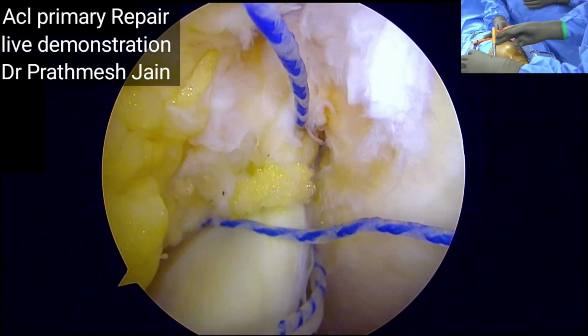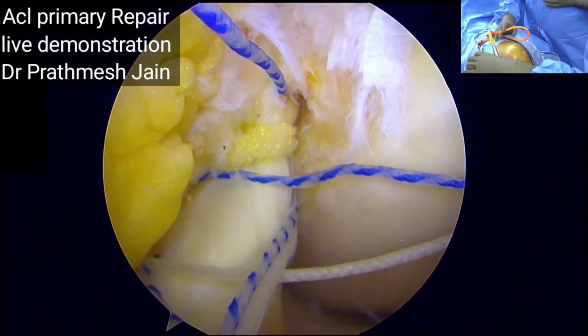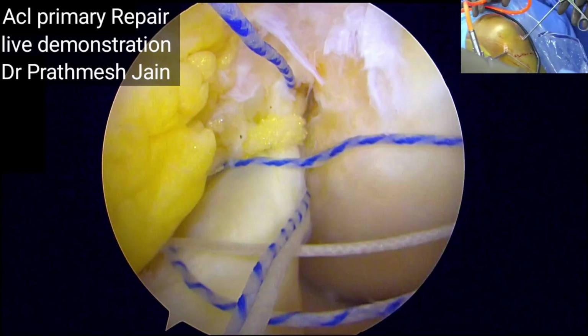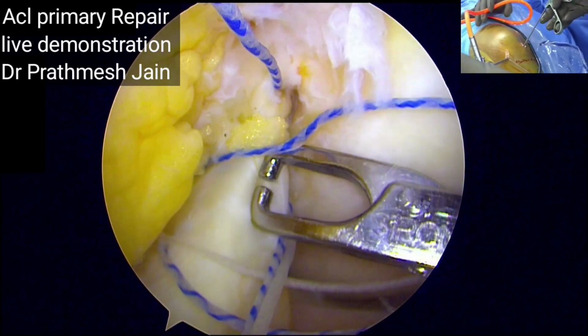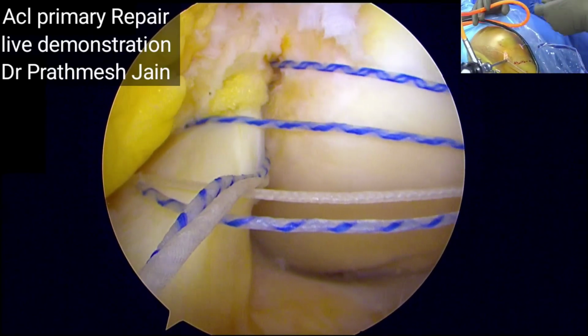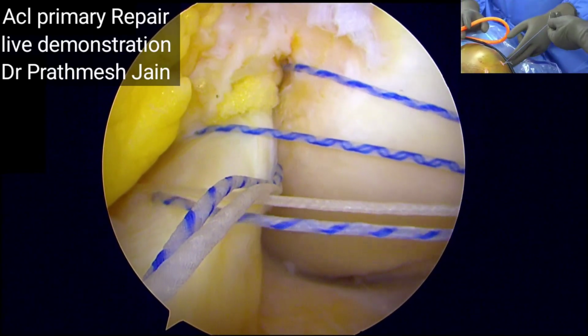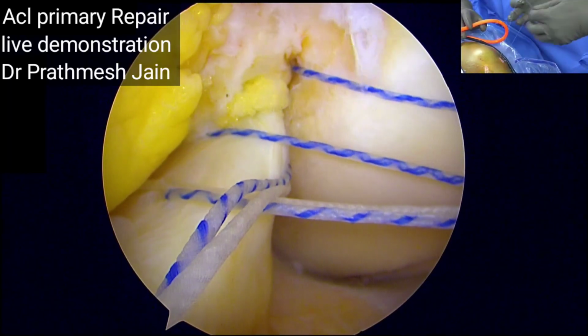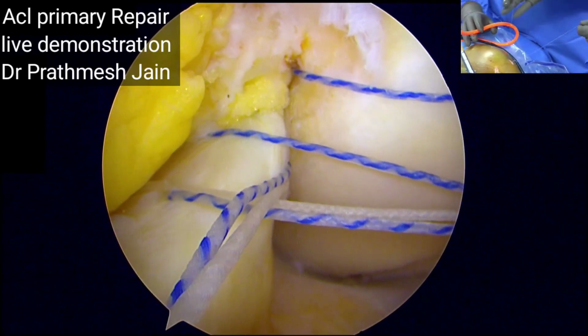Now I would be tying my second suture limb. This is again for the AM bundle, the superior part or the superior anchor. It goes like this. I try the other one, I pick it up, and again make the knot on the ACL, the tissue which is passing through the tissue.